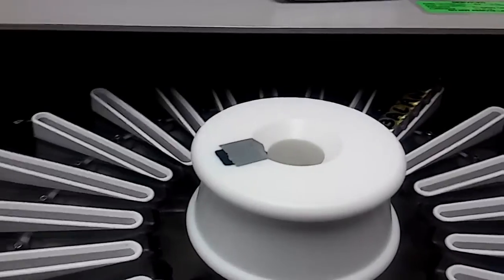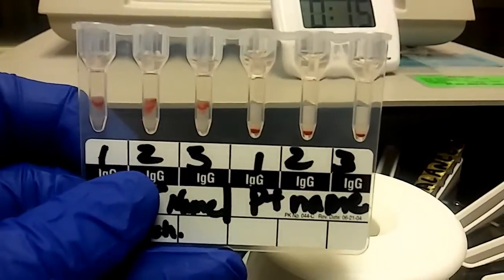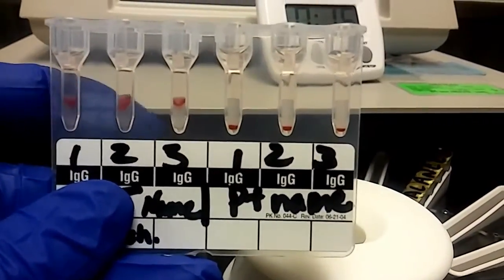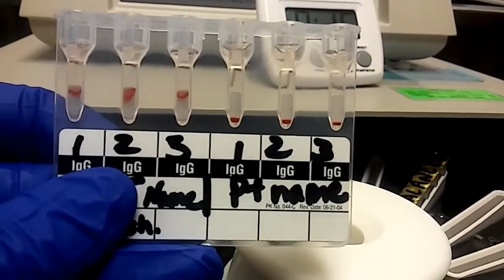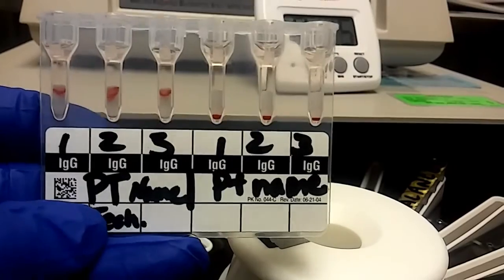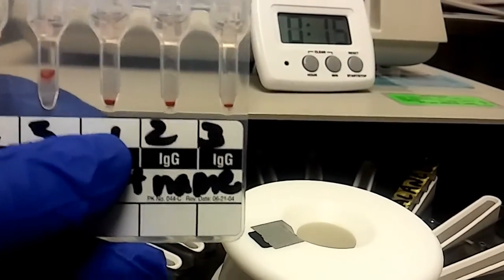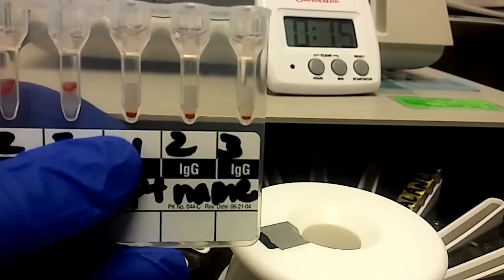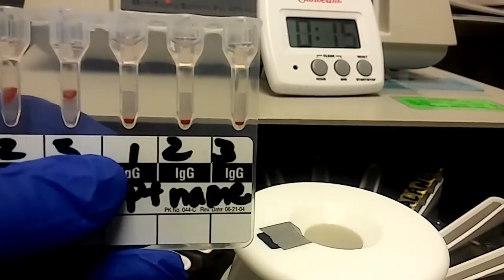As you can see, the first one is between a three and four plus — that's like a three plus — and that one's about a four plus. So those are all supposed to be positive based on the QC we used. Then one, two, and three on the other side are all negative, so those we would record as zero or negative.